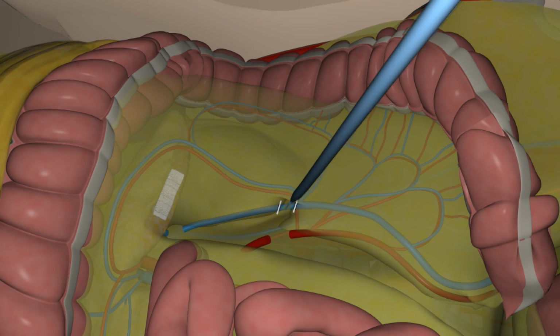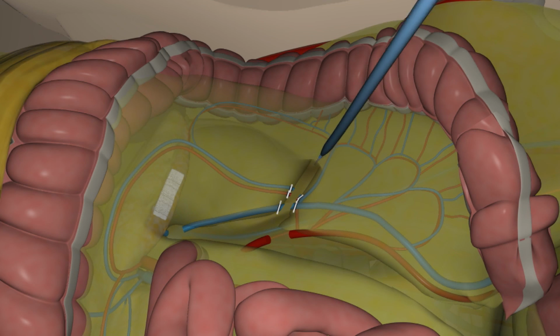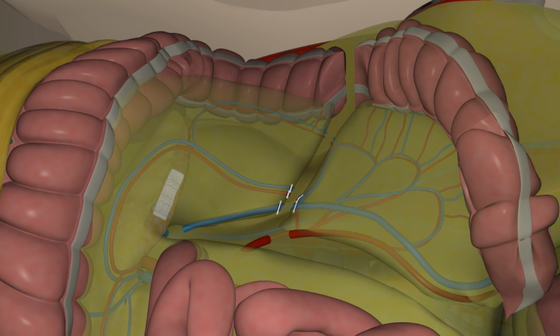The proximal division site should be located at least 10 to 15 cm proximal to the tumor because of the pericolic lymphatic clearance. It is performed by the preparation of the lymphovascular pedicle first, dividing the descending mesocolon and subsequently the bowel.